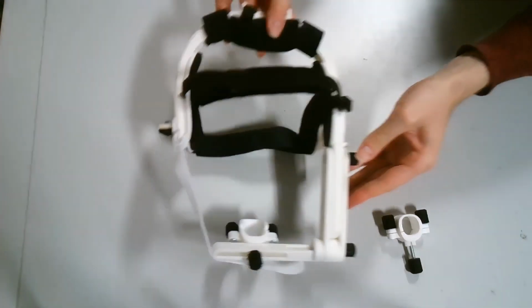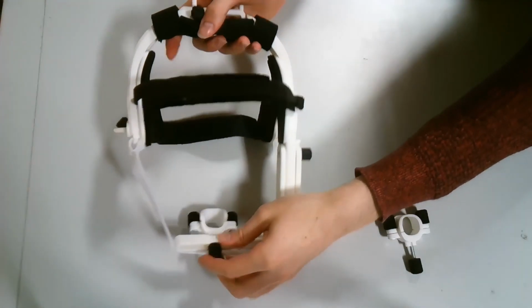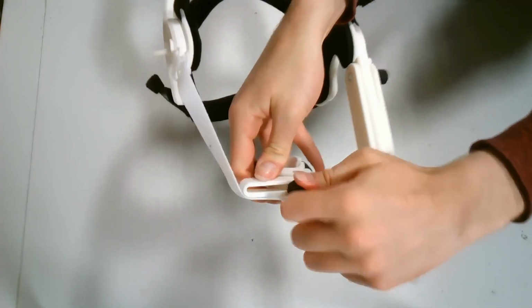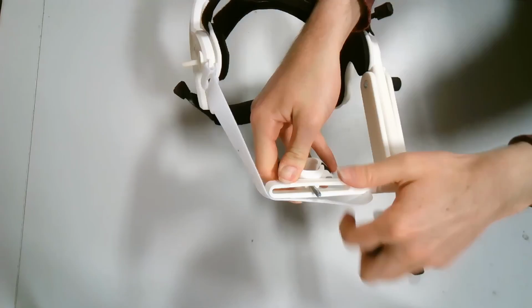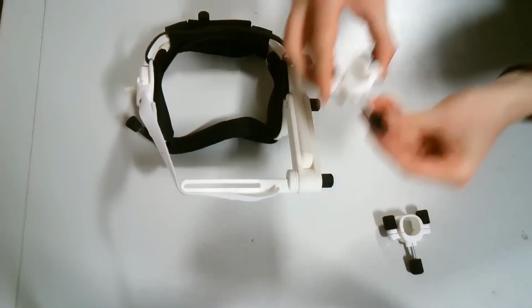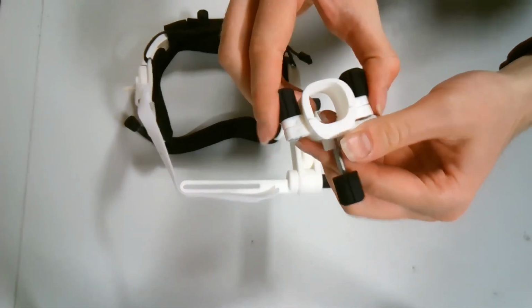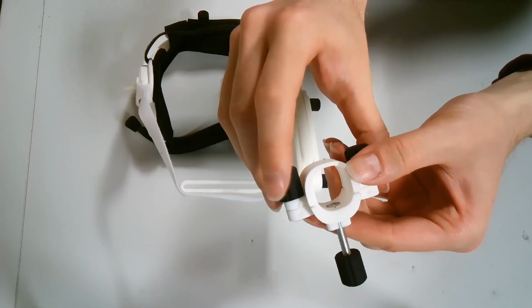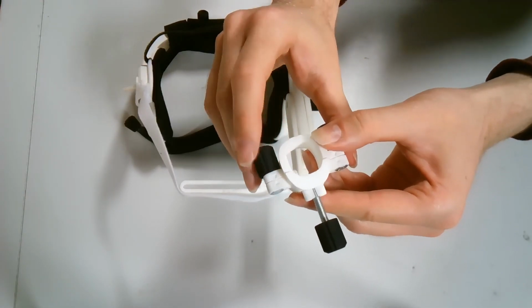If you purchased an Ultrafit headset, you can change the size of the ultrasound probe holder. Remove the old probe holder by unscrewing it from the arm. Attach the new probe holder so the arrows on the sides are facing up.